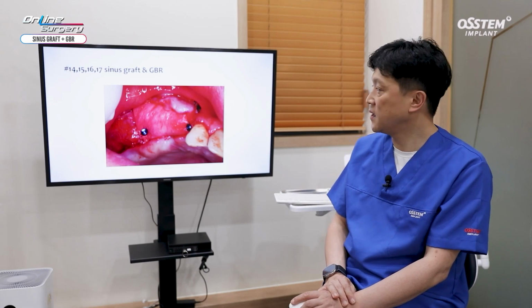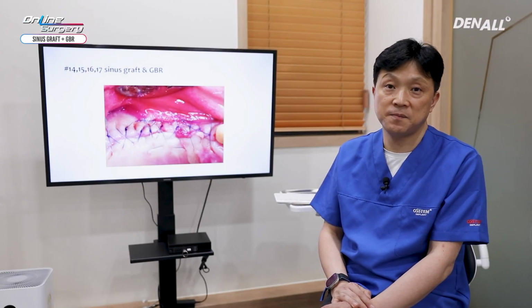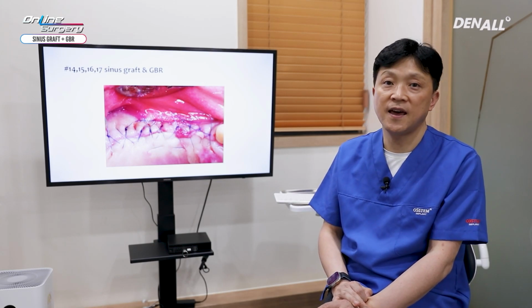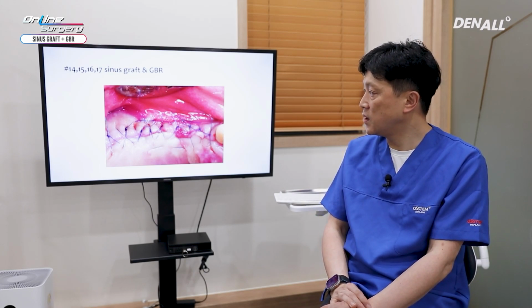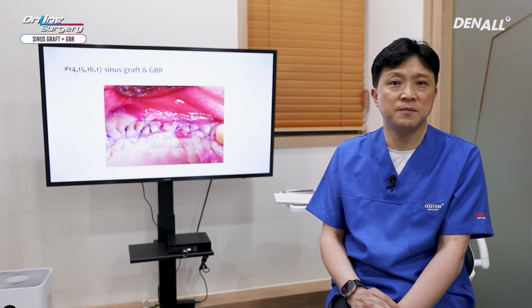Next time, if the opportunity arises, I'd like to share the online surgery clip of when the implants will be placed here. And I want to give you an overview of what has transpired. I've decided to dedicate more time for healing. Many people say that after 4 months you can place implants, but my plan is to wait 5 months for implant placement.